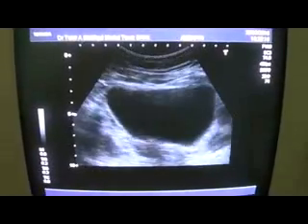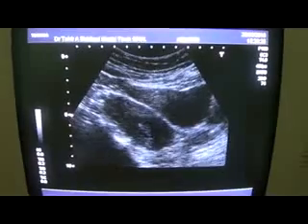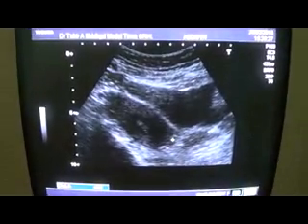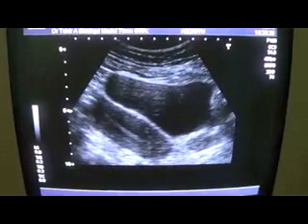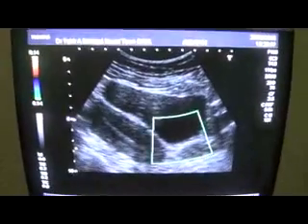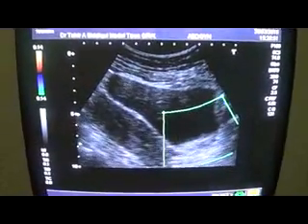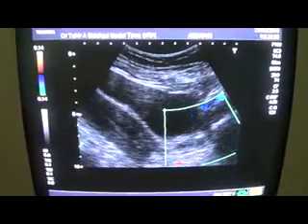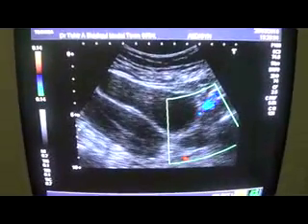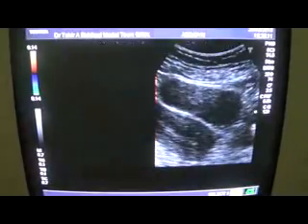Okay, now whatever we get, we should straight away see that and then move on to the other study. This is the left ovary, showing you no follicular activity. Right was also showing no follicular activity. See, this is the left ovary. These are the iliac vessels as per the landmarks. So clearly seen, these are the iliac vessels, this is the ovary. Now we come to the main study.